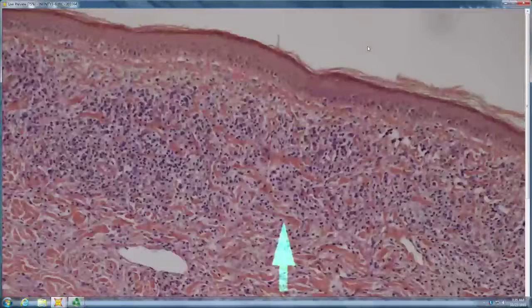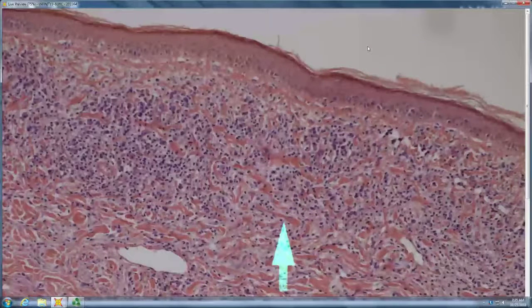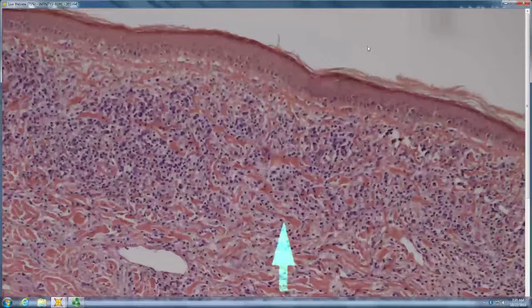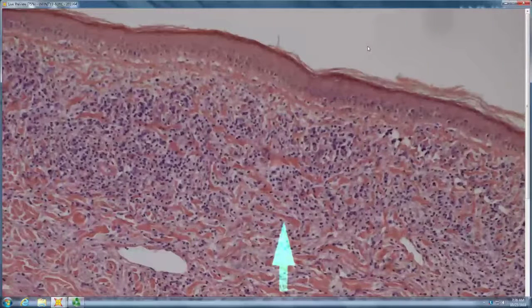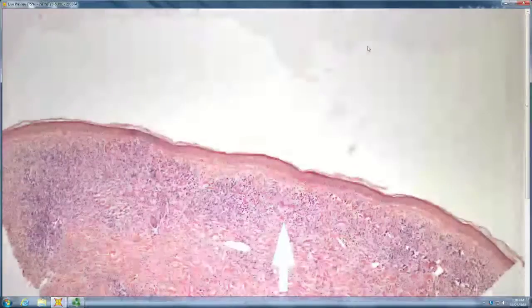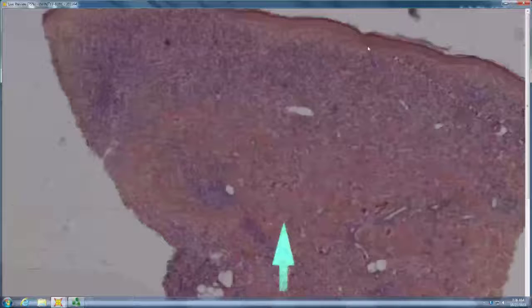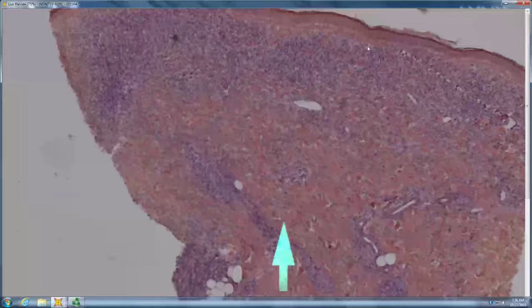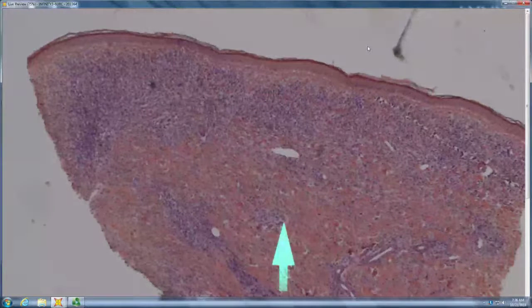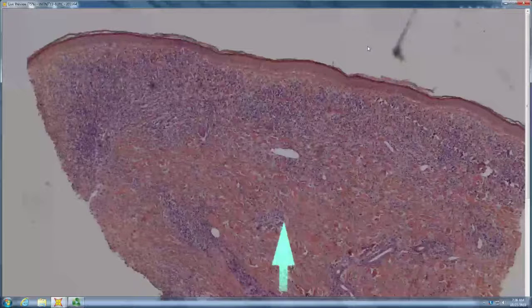Do you know of anything that would be a broader lymphohistiocytic band with plasma cells and degeneration of collagen? Lichen myxedematosus, scleromyxedema: you get new ropey collagen and a mixed inflammatory infiltrate, a busy dermis. Does that tend to be top heavy or bottom heavy? Top heavy. Usually the inflammatory cells are very sparse, and what you see is just too many fibroblasts with ropey collagen. In this case, it really is a prominent lymphohistiocytic and plasmacytic band, right?